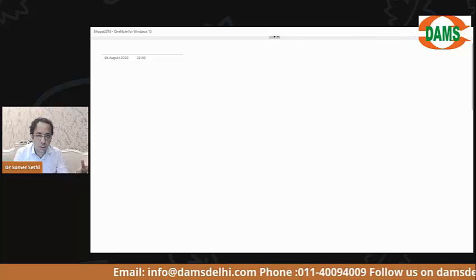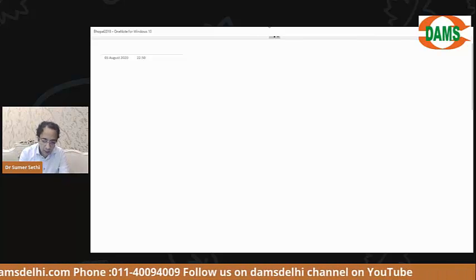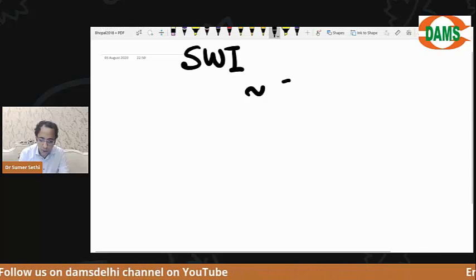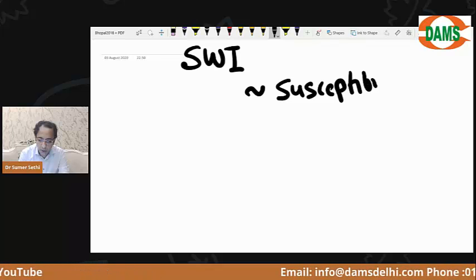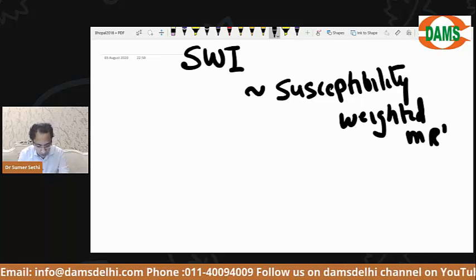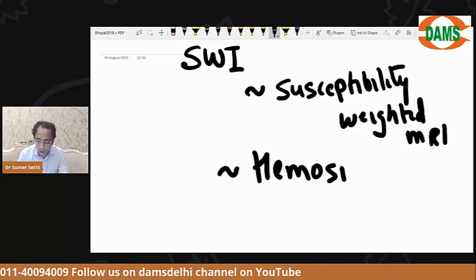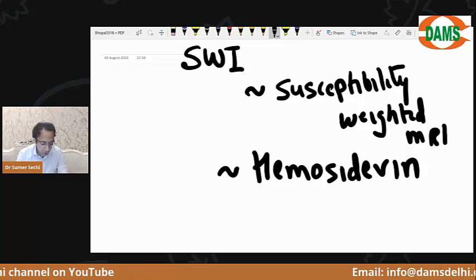We are unable to differentiate on a CT. So far I have told you SWI is a special MRI sequence called susceptibility weighted MRI, good for hemosiderin detection in the brain. Chronic bleed. Hemosiderin is chronic bleed. That is what we talked about.